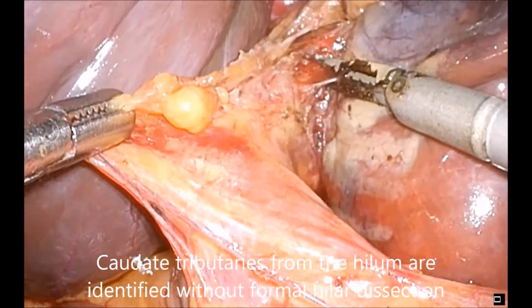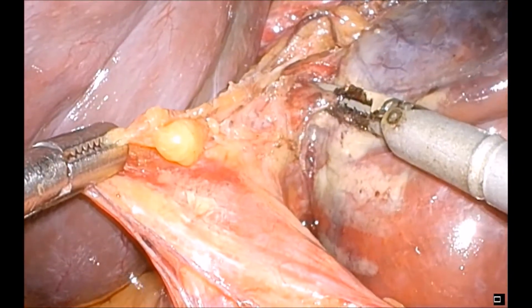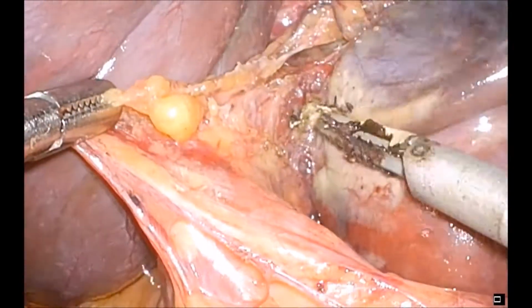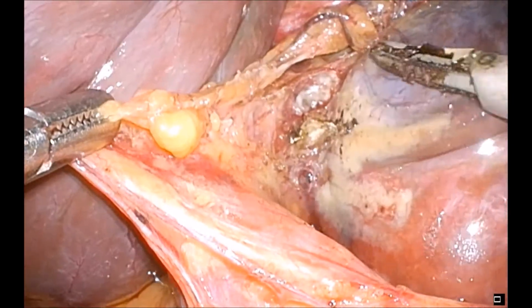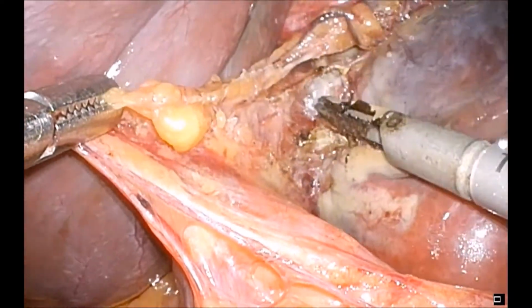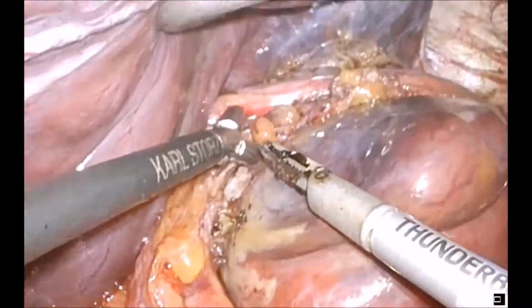Small tributaries from the hilum to the caudate lobe are divided again with bipolar diathermy at this point. These are really feeding the adenoma, which is the obvious large expansion of the caudate lobe here.